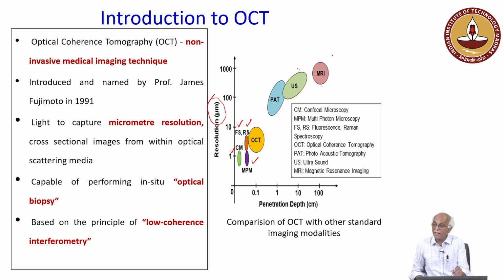Now, in fact this OCT approach was first introduced, with the technique which I will describe at a later stage, by James Fujimoto from MIT, Massachusetts Institute of Technology, in the 1990s. Today most ophthalmologists, and some applications related to skin measurements, find this OCT technique very much applicable.